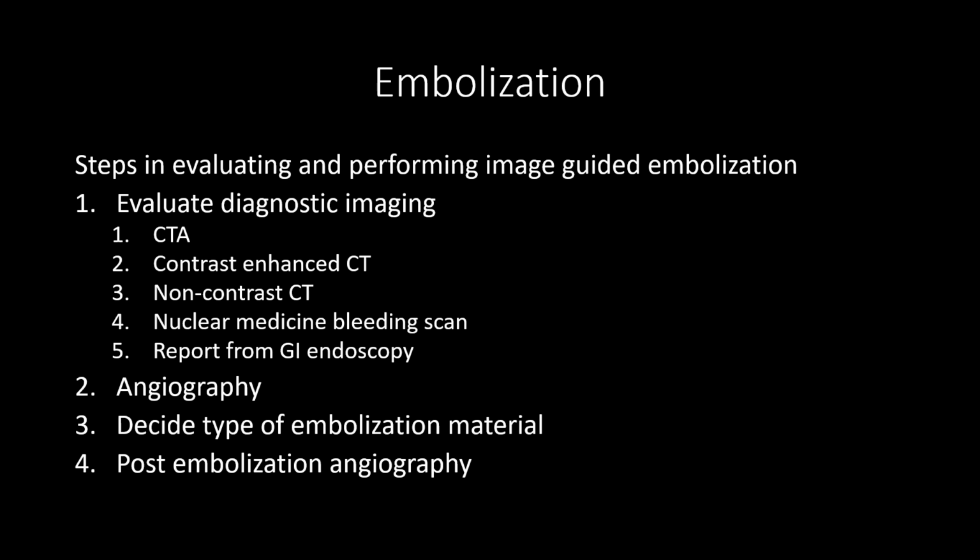So those multi-phase studies help us to truly see where active hemorrhage is, and then we don't get fooled by something bright that's not contrast. If we can't get a CTA, just a normal contrast enhanced CT would be our second best. Not quite as good as a multi-phase CT examination, but still pretty darn good.